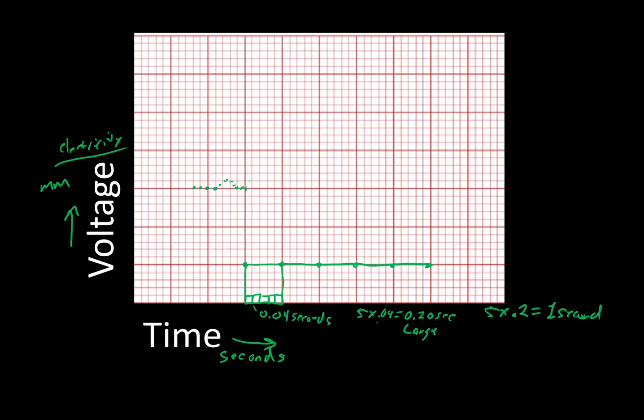And then all of a sudden, if it measures a lot of electricity moving towards it, every millisecond, just more and more, and then it measures a little less, and then a little less, and then a little less. Now the electricity is actually flowing away from it, quite a bit actually. Well, the electricity is still flowing away from it, but then there was less than a second ago.